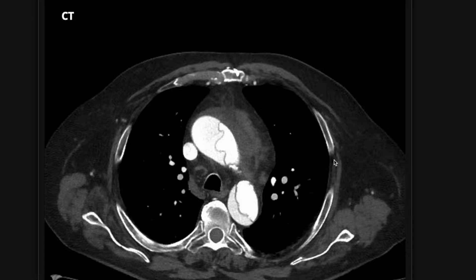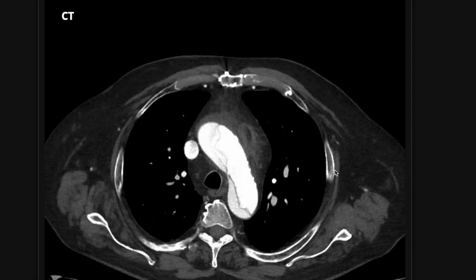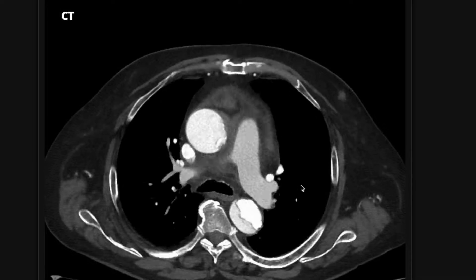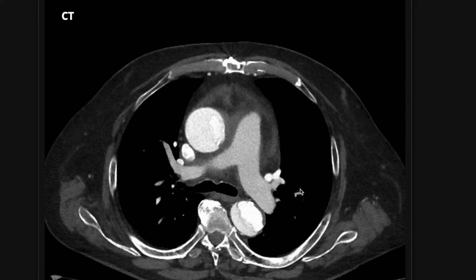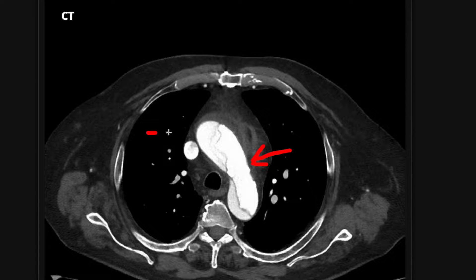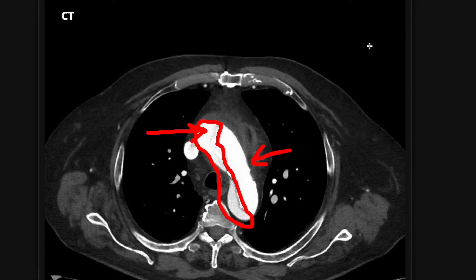An aortic dissection results from tearing of the intimal layer of the vessel. Blood then leaks into a created space — the false lumen — that forms between the intima and the other layers of the aorta. This creates what we call a true lumen and a false lumen. The true lumen is the brighter one; in this case it's on the inside. The false lumen is a little bit less bright, and that's where the blood is leaking into.